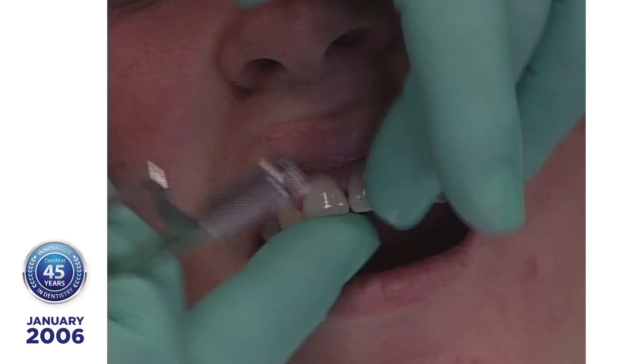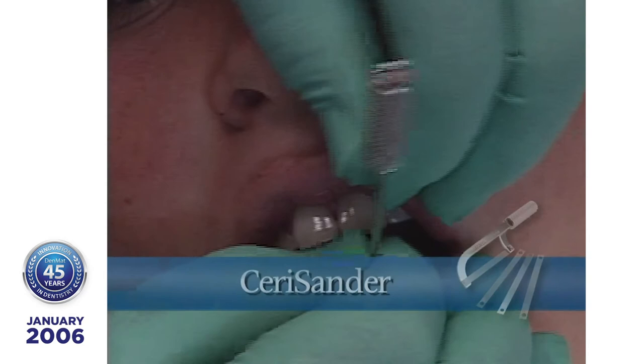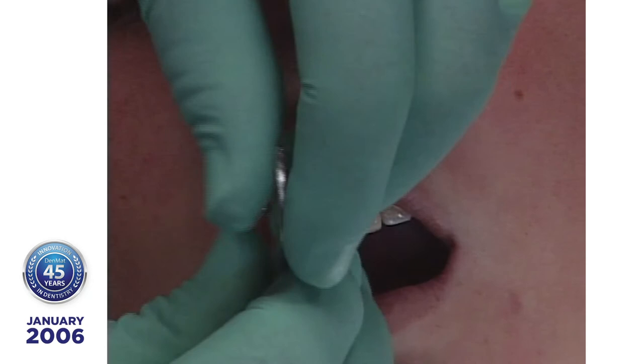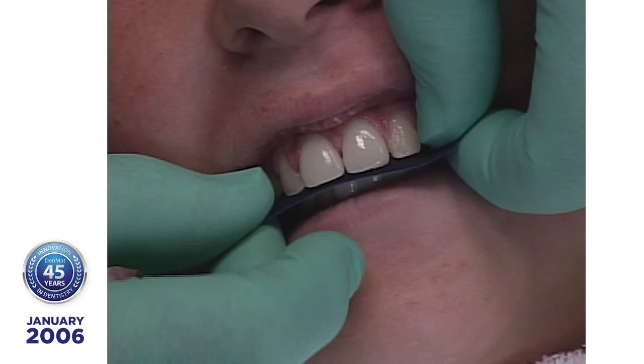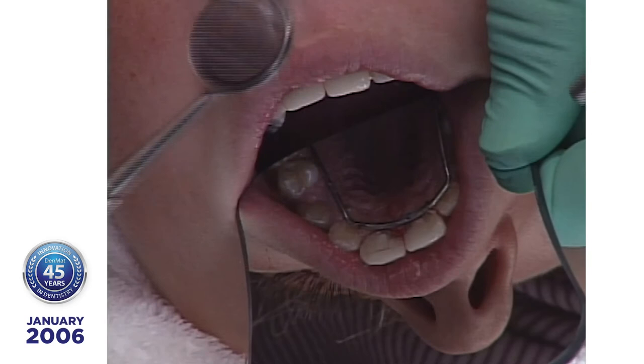Any rough edges in the interproximal are smoothed with the use of a CeriSander, a one-sided fine-grit polishing strip and an easy-to-use handle. Before releasing the patient, adjust the occlusion in Centric throughout all excursive contacts. Proper occlusion on natural tooth surface will help ensure long-term success. This technique for placing multiple lumineers preserves tooth structure and the procedure is simple and time-efficient. Cerinate porcelain has been clinically proven in tens of thousands of cases to be exceptionally durable and reliable.